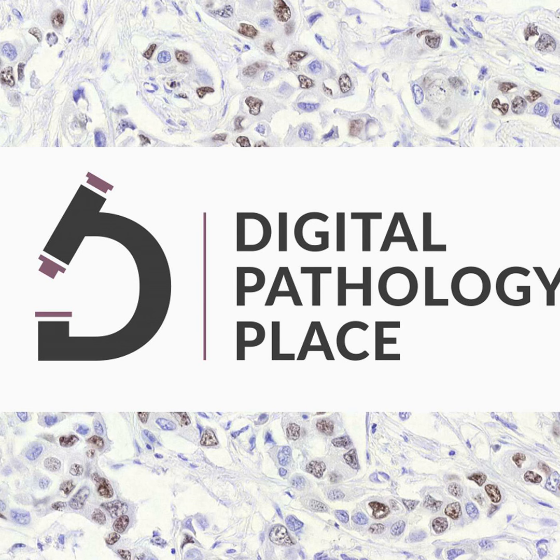Yeah, and to be honest, people often refer to major features of DICOM in terms of their supplements. So when they talk about the DICOM whole slide image format, they refer to supplement 145, which was added in 2010 to extend DICOM to support whole slide images. And so if in your contracts you refer to supplement 222, that's not the end of the world in terms of demanding a particular choice of format for annotation interoperability. And the vendors will either understand or come to learn what that means, and that can be your point of compliance in the contract with respect to adding support for this feature.